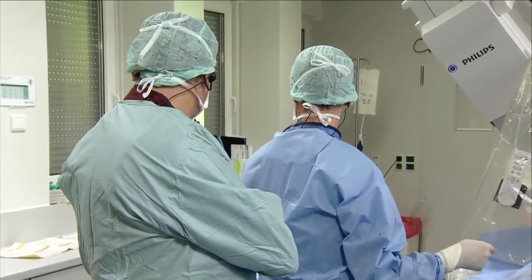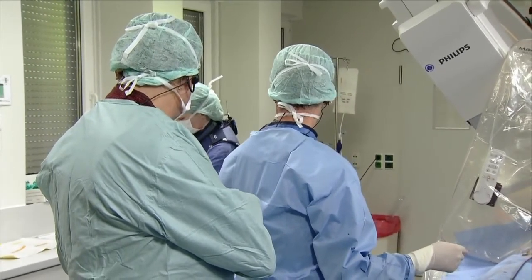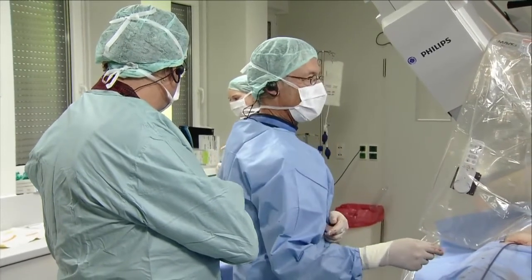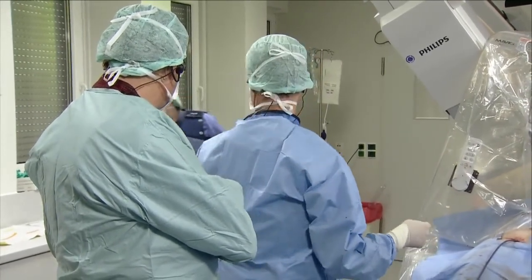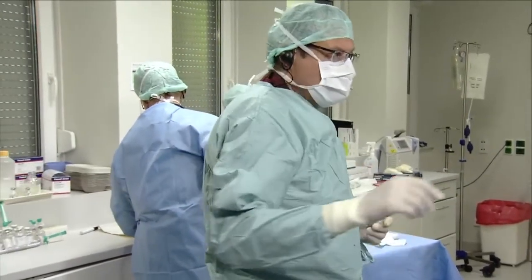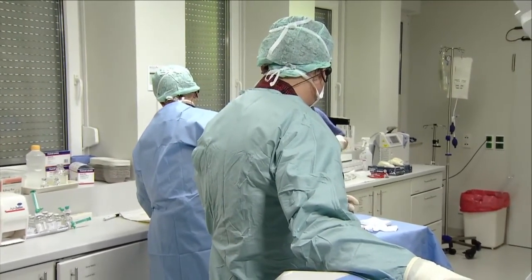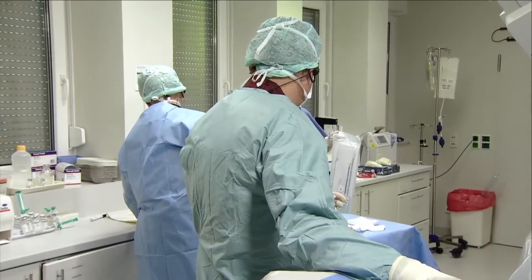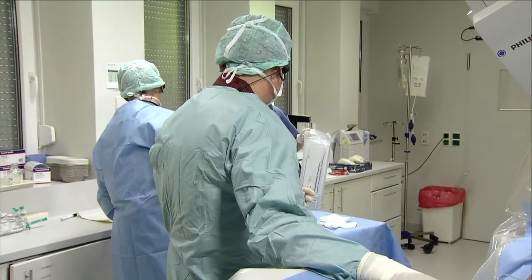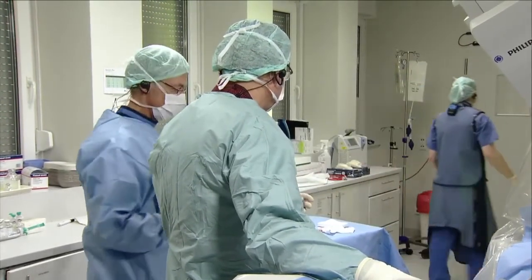The special size with the smallest umbrella. I think this is 18 or 16. 1630. 1630 or 1632? No, 1630, and then the next is 1832. So there isn't a 1632 then? No, maybe there should be. That would be 18 then. Well, the smallest one is 16 by 30 and then 18 by 32. So which one? Take the biggest. 16. Yeah, Kevin? 16. Okay, we seem to have agreement.